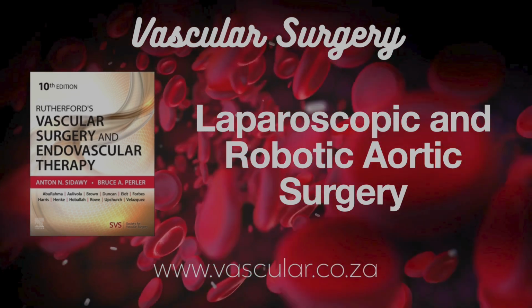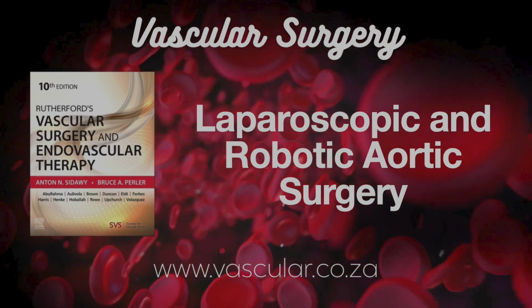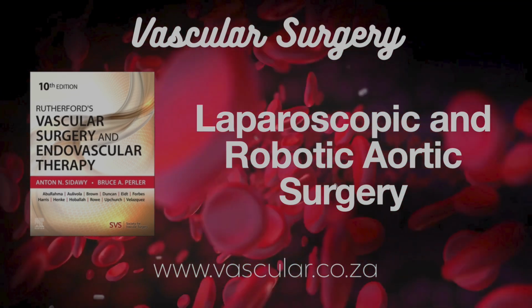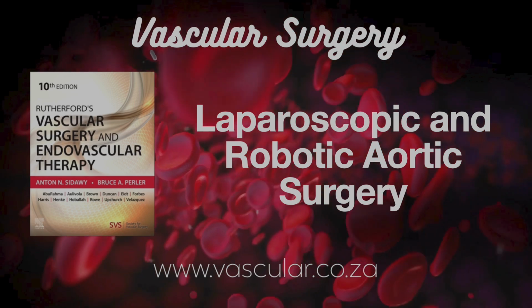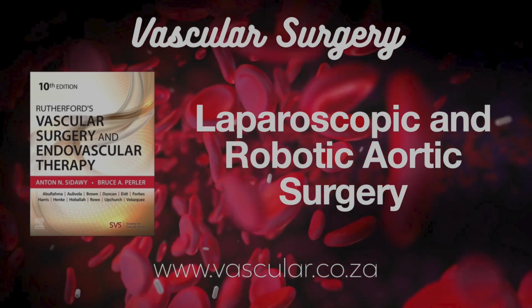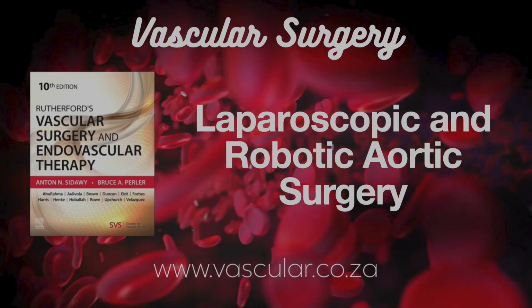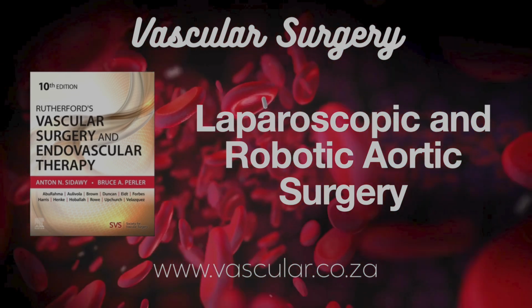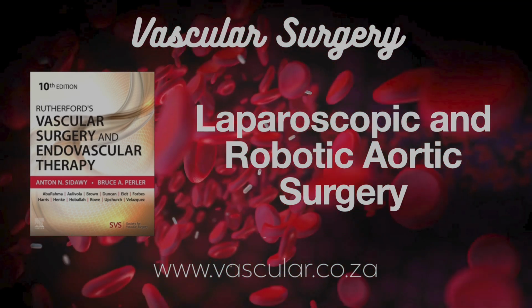What about clamp time? How long is blood flow stopped? Similar story, a significant variation. Shortest average was HALS for occlusive disease, maybe around 28 minutes in some reports. Longest was TLAS for aneurysm repair, averaging maybe 146 minutes, but again, depends hugely on the center, the surgeon, the patient. Understood.